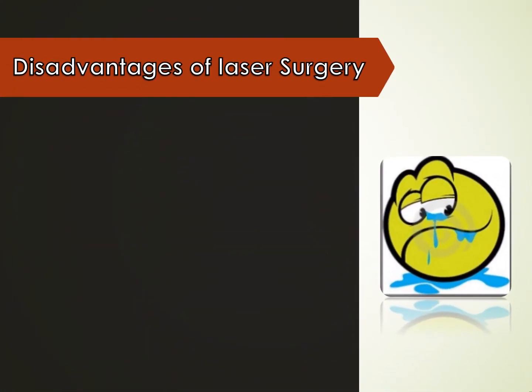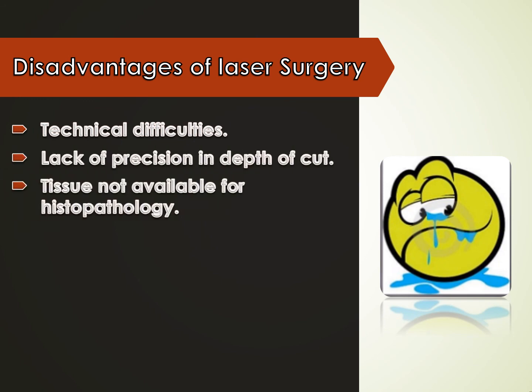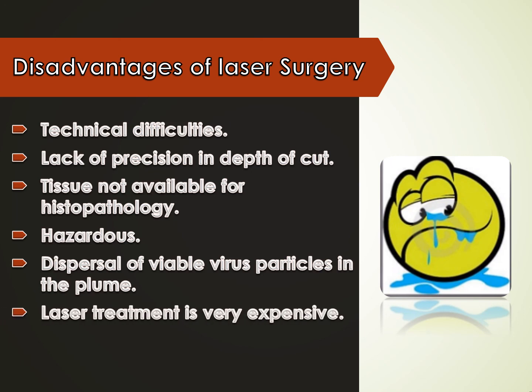Disadvantages of laser surgery: technical difficulties, lack of precision in the depth of the cut, tissue not available for histopathology, hazardous, dispersal of viable virus particles in the plume. Laser treatment is very expensive.